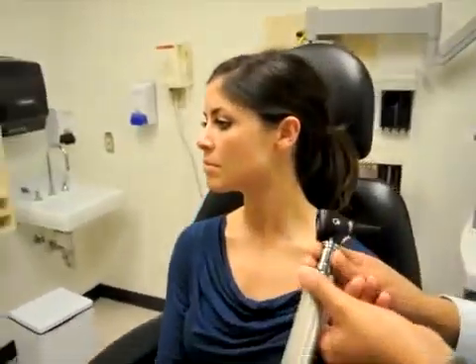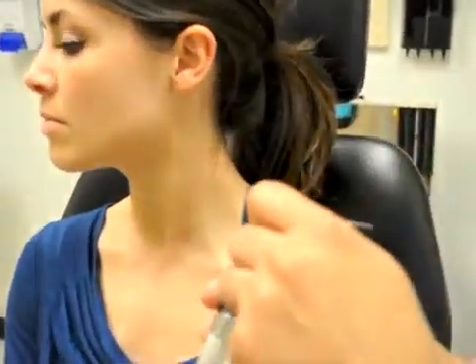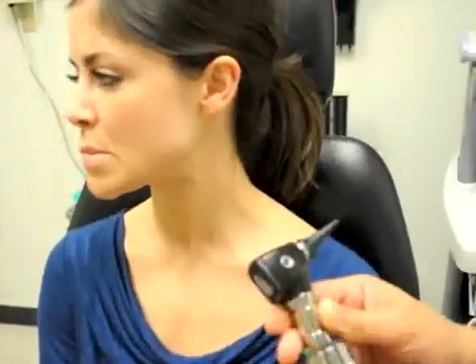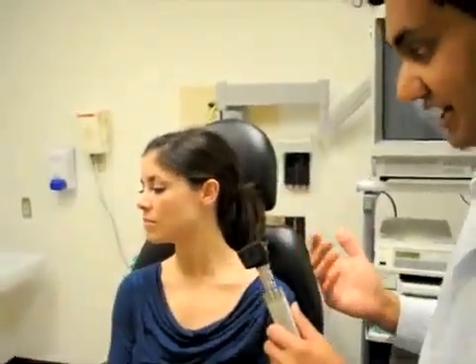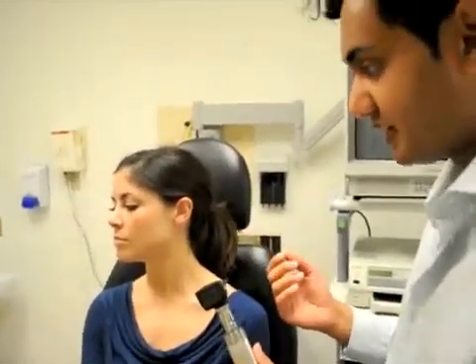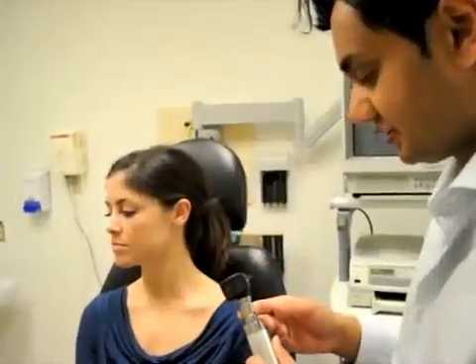An otoscope also has an attachment on the side of it here to which a bulb can be attached. With this bulb, I can pump pressure through the otoscope and actually see the tympanic membrane moving. If the middle ear space contained fluid, the tympanic membrane would not move. So it is a very good diagnostic tool for diagnosing things such as an otitis media with an effusion or an acute otitis media with pus behind the eardrum.